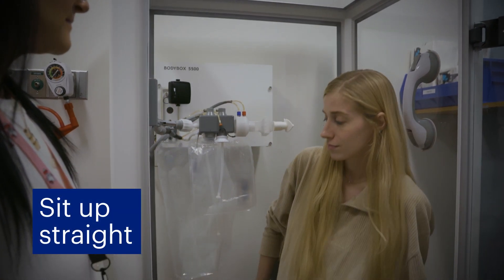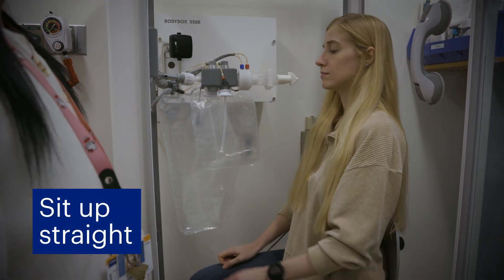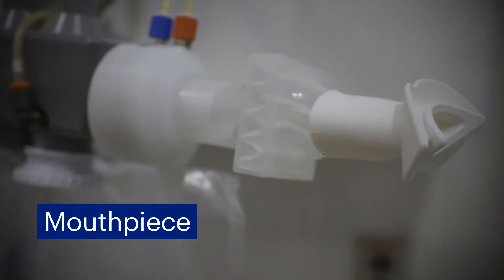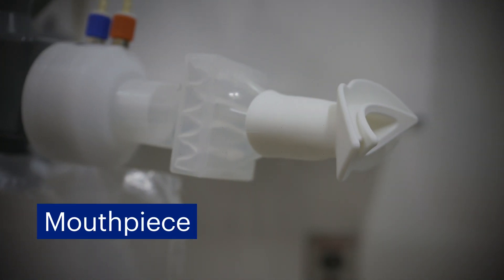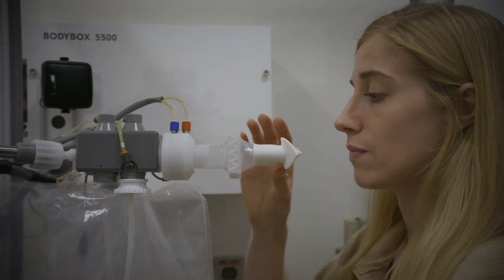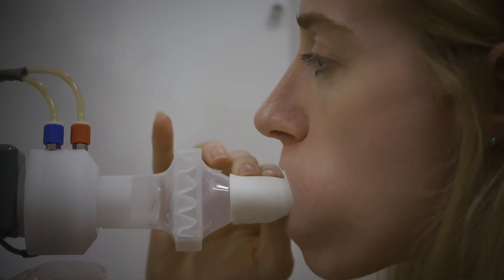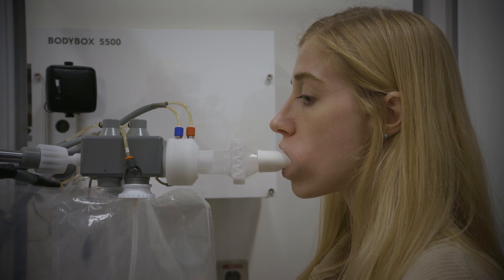The tests require that you sit up straight in the chair with your feet flat on the floor. They also require the use of a mouthpiece so that the machine can measure the breaths through your mouth. The mouthpiece may feel uncomfortable, but it is very important to keep a tight seal with your lips to prevent any air from leaking and to get accurate results.